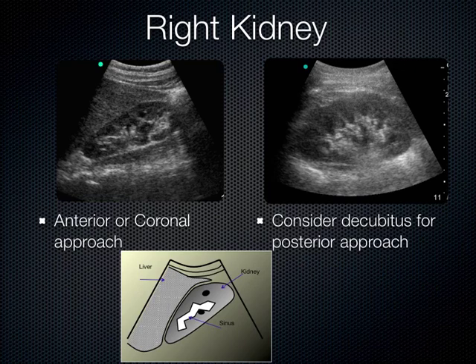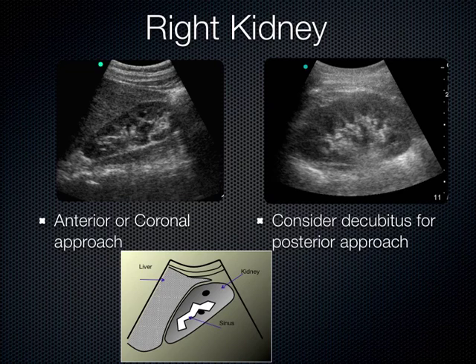We can see the kidney here with the cortex, and the adjacent liver on the right side. Sometimes a loop of bowel blocks the lower pole of the kidney — bowel gas being the enemy of ultrasound. Moving the probe more posteriorly allows us to see the entire kidney in one view. On the left side, because the spleen isn't as large, we lose more of the lower pole, so I go more posteriorly more often on the left.